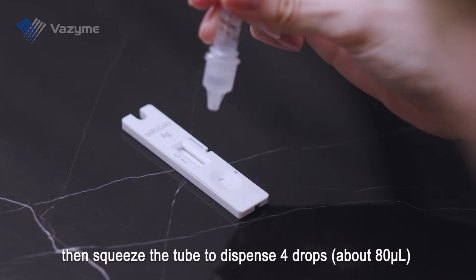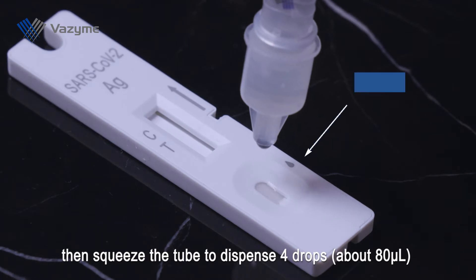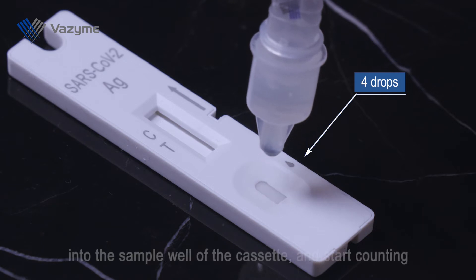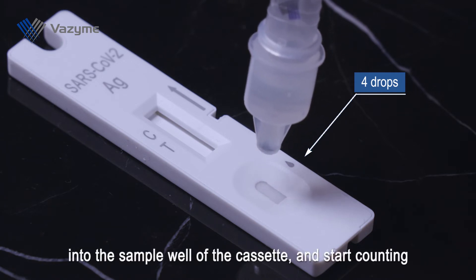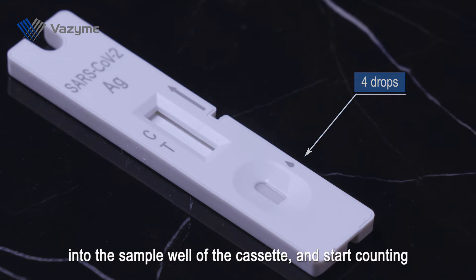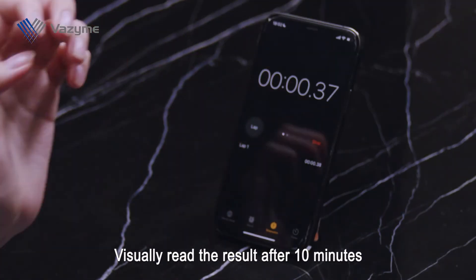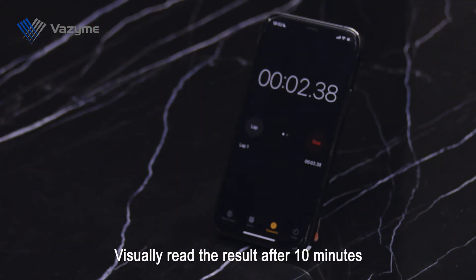Cap the sampled eluent tube upside down, then squeeze the tube to dispense 4 drops, about 80 microliters, into the sample well of the cassette. Start counting and visually read the result after 10 minutes.